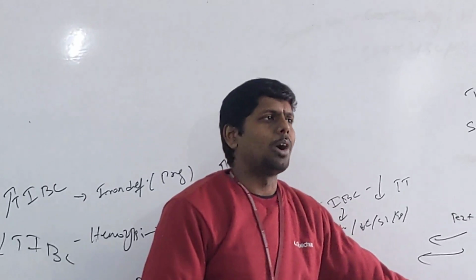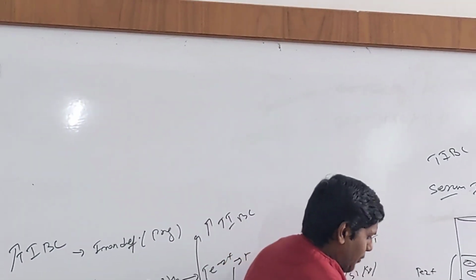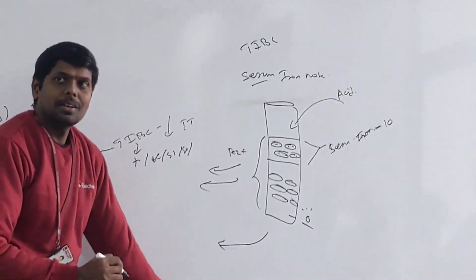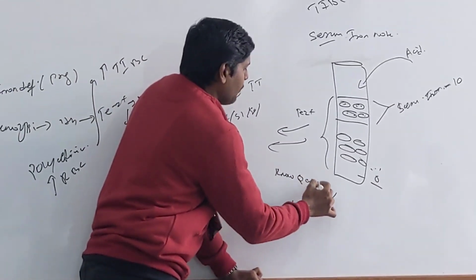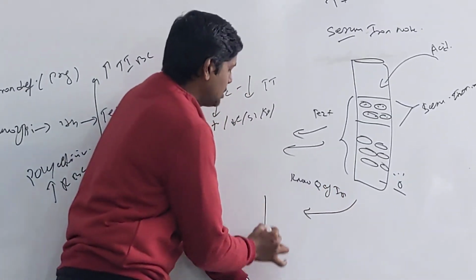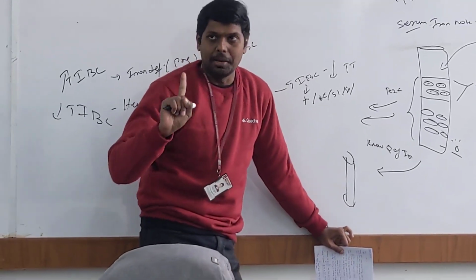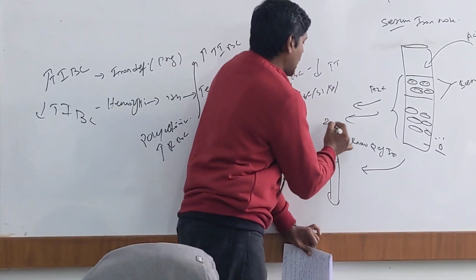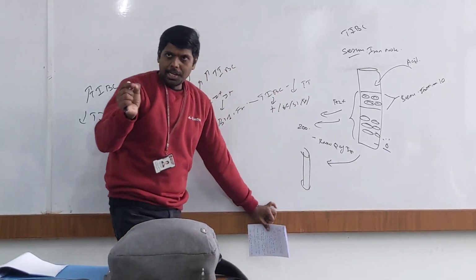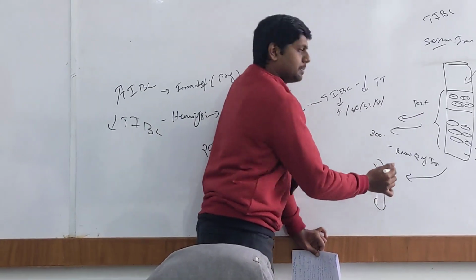Why did I remove all the iron molecules? Now I will let you know. Listen. The next step will be to add a known quantity of iron molecules to this test tube. I will give you an example. The known quantity is 200. I already know how many iron molecules I am adding. I added 200 molecules to the test tube.